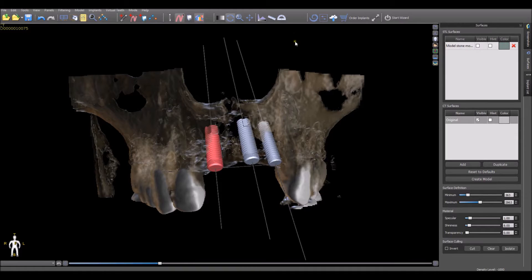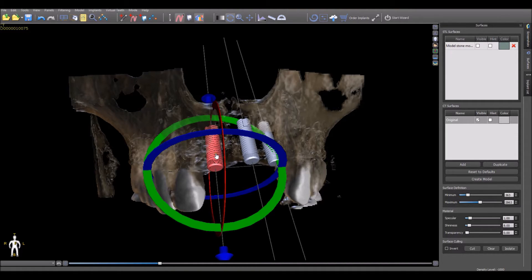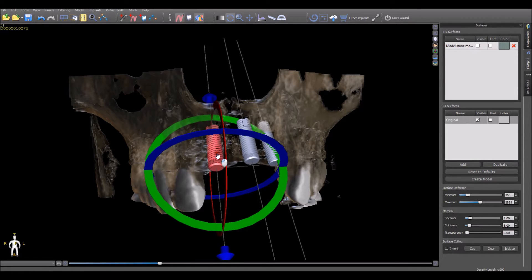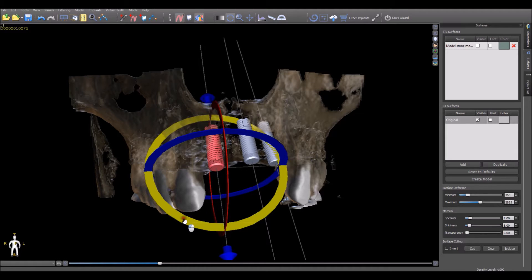Standard functionality allows an implant, virtual tooth, or model simply to be clicked on, grabbed, and dragged, and moved in any direction. In addition, the implant, virtual tooth, or model can be rotated by simply grabbing the widget and dragging it accordingly.